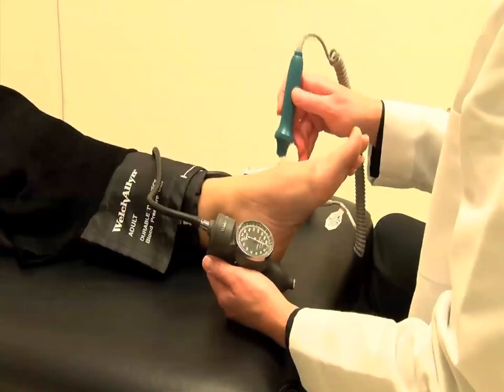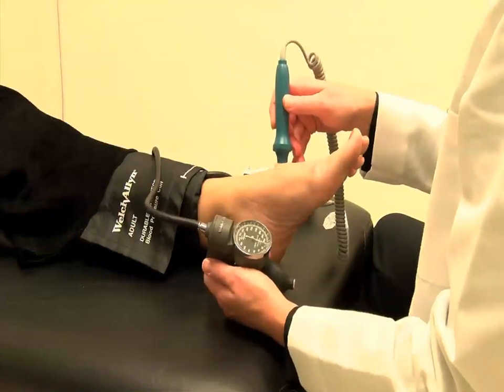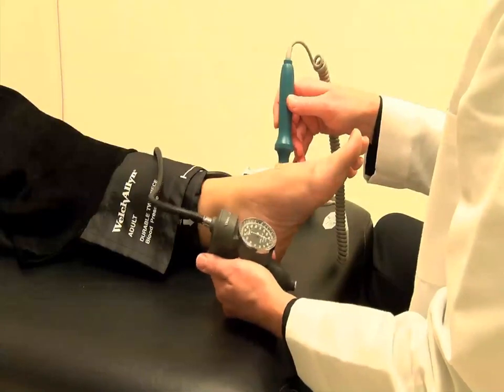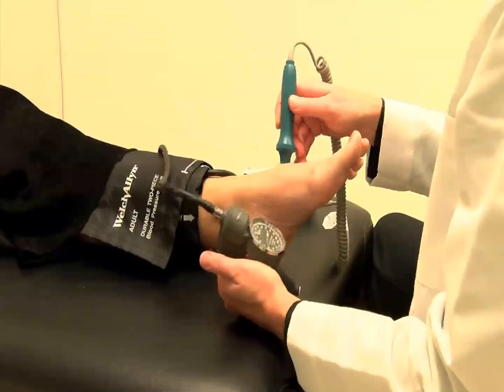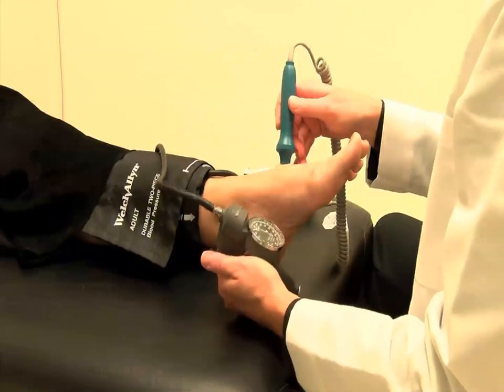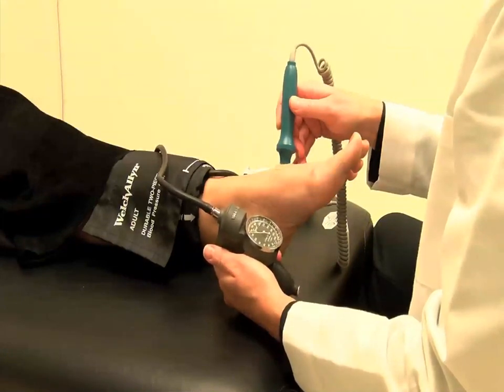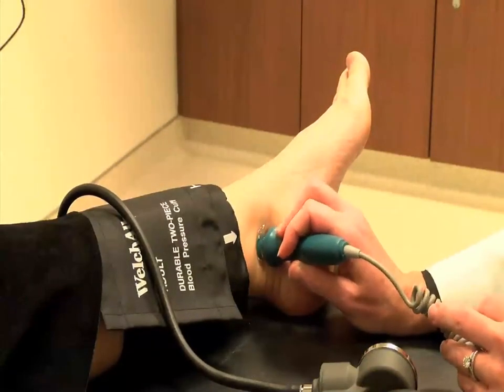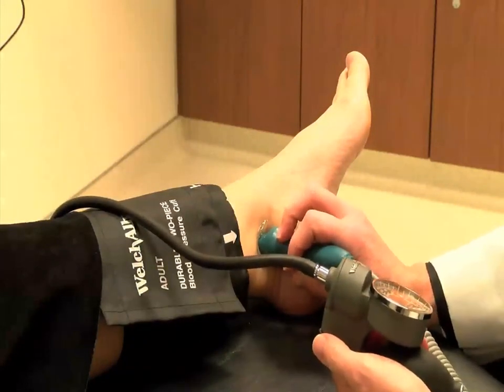Then apply a generous amount of ultrasound gel to the dorsalis pedis pulse. Once again, locate the dorsalis pedis pulse, holding the handheld Doppler probe at a 45 to 60 degree angle toward the heart. Slowly adjust the Doppler until you can appreciate the loudest pulse sound. Then inflate the cuff until the Doppler signal disappears. Gradually release the pressure valve until the pulse signal returns. Be sure to take note of the pressure at which the pulse signal returns. Repeat the above steps for the other foot and record the highest systolic pressure measurement between the dorsalis pedis and the posterior tibial pulse signals.